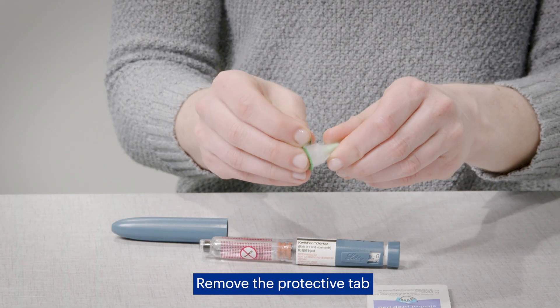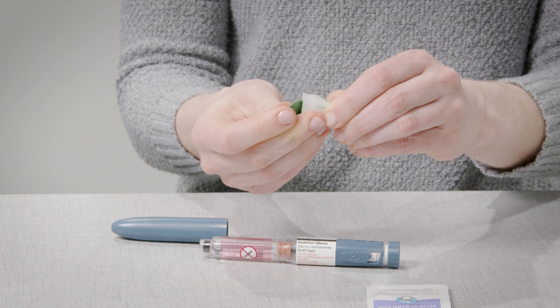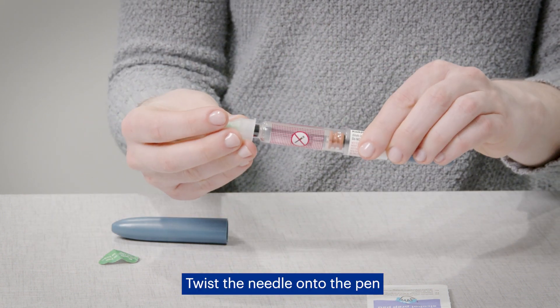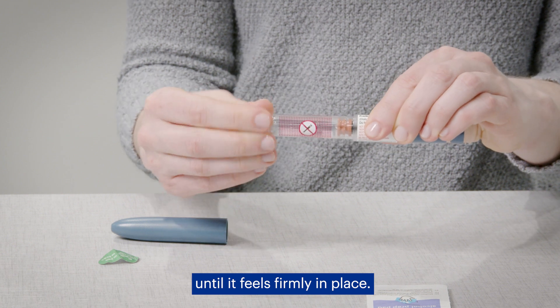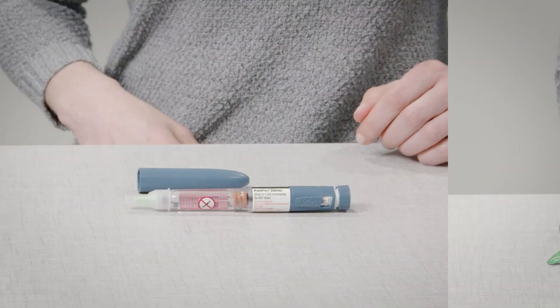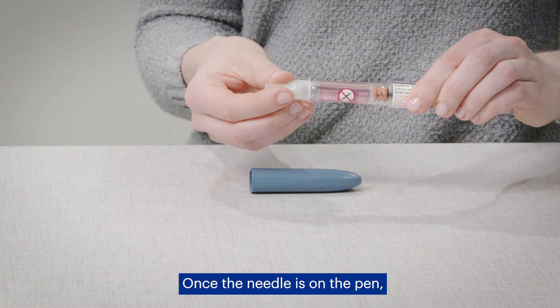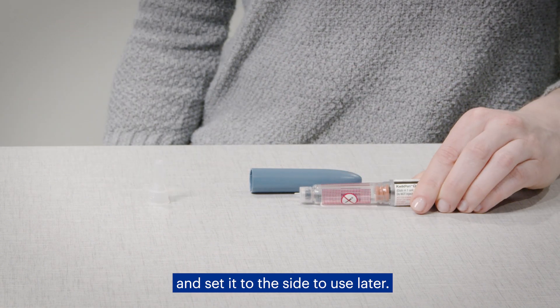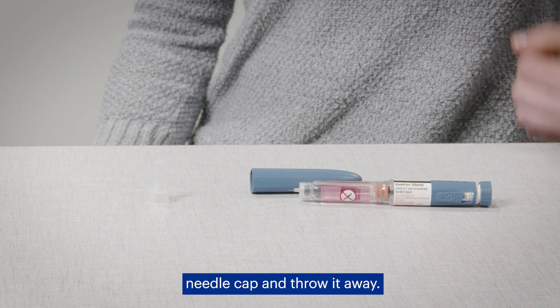Remove the protective tab from the insulin pen needle. Twist the needle onto the pen until it feels firmly in place, keeping the needle straight as you twist it on. Once the needle is on the pen, remove the outer needle cap and set it to the side to use later. Take off the inner needle cap and throw it away.